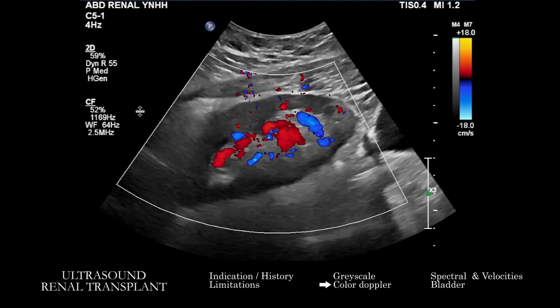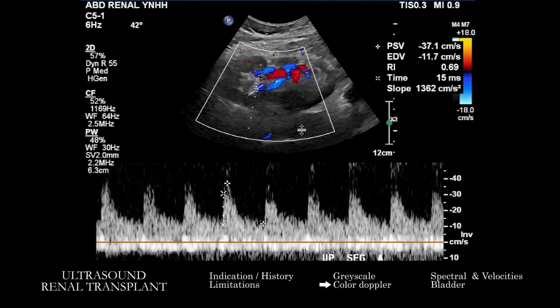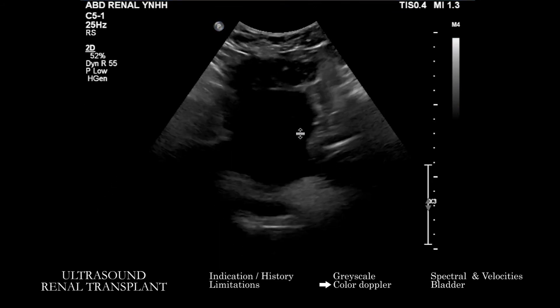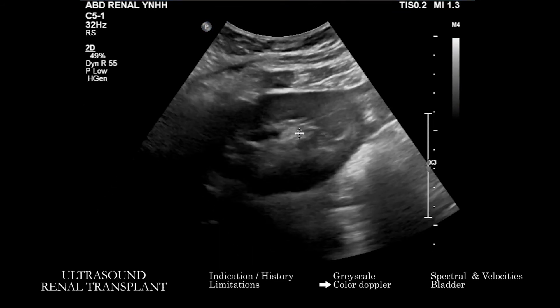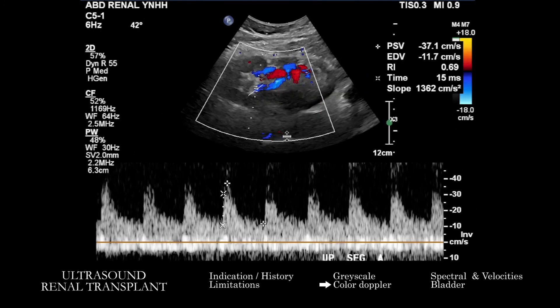When we have the color Doppler images, we're looking grossly — because we'll also look more specifically on spectral Doppler — is the arterial and venous vasculature grossly patent? Is there symmetric flow? Are there areas where we have a correlate abnormality on color Doppler and on grayscale images? Is there any sort of focal abnormality that would make you think about a pseudoaneurysm or an AV fistula, especially in the setting of prior biopsy? Or can we characterize it on these sorts of images?